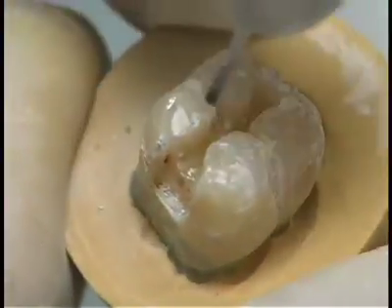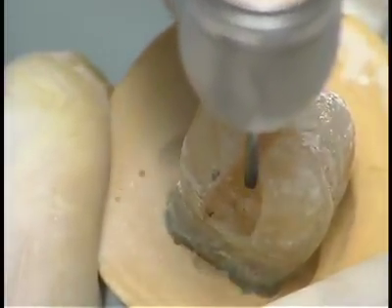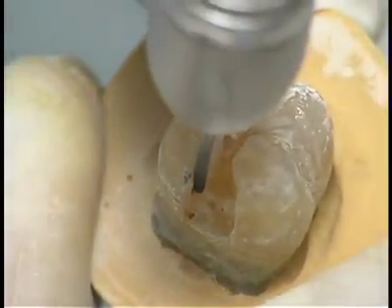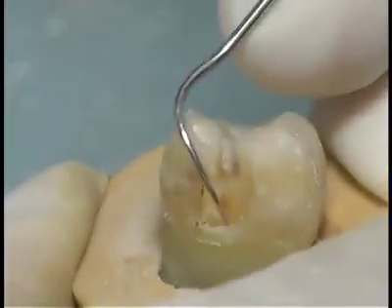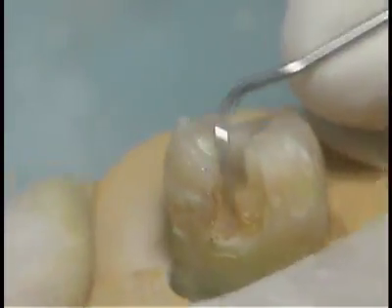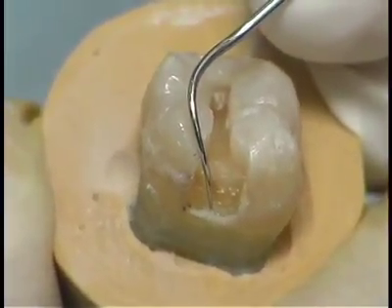5. The axial wall is convex in the horizontal section. 6. The axial wall is 0.5 to 0.8 mm into dentin. 7. The reverse curve preserves the triangular ridge and facilitates the formation of a 90-degree angle between the proximal walls and the tangent of the proximal surface. 8. The occlusal and proximal segment flow together smoothly.